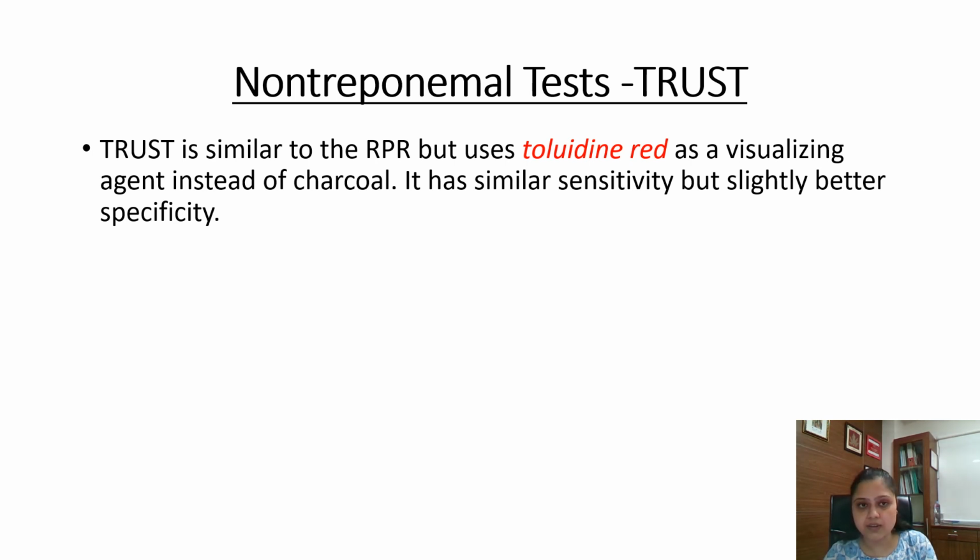Coming to the last non-treponemal test, that is the TRUST, which is not commonly employed. However, it is similar to RPR, and it uses toluidine red as a visualizing agent instead of charcoal, and sensitivity wise it is similar but slightly better in terms of specificity.